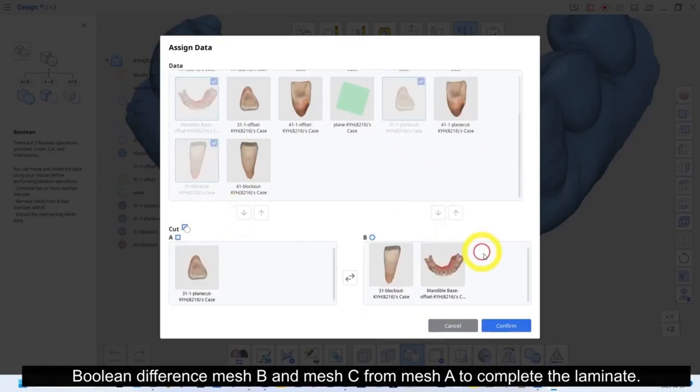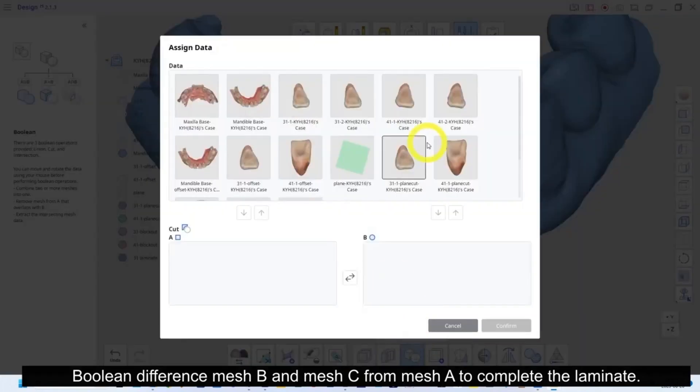Boolean difference of mesh B and mesh C from mesh A to complete the laminate.